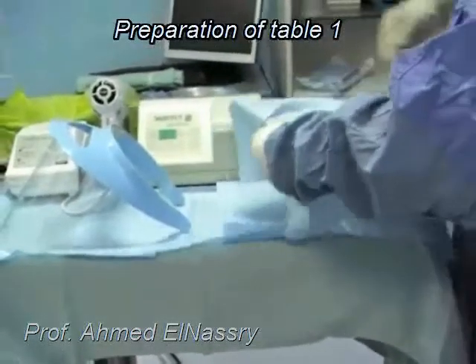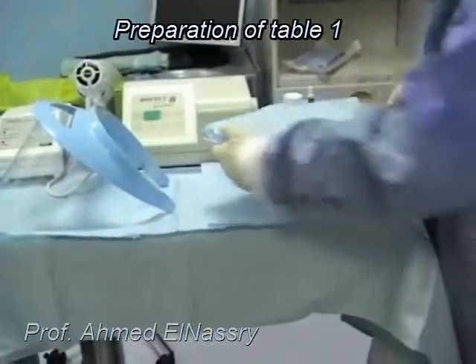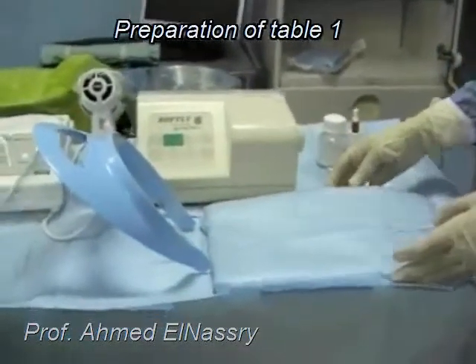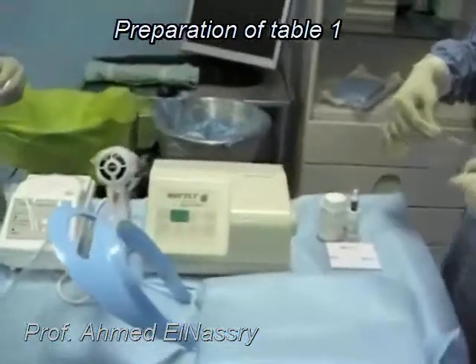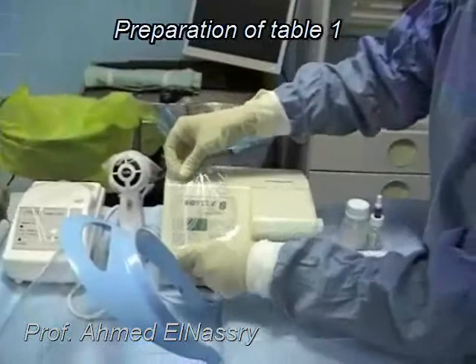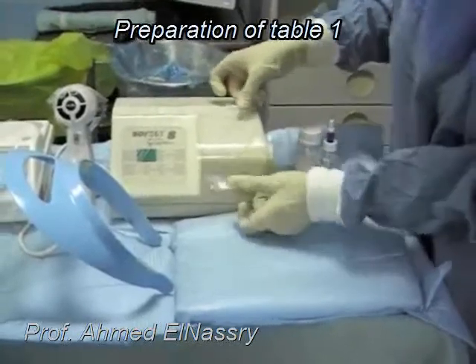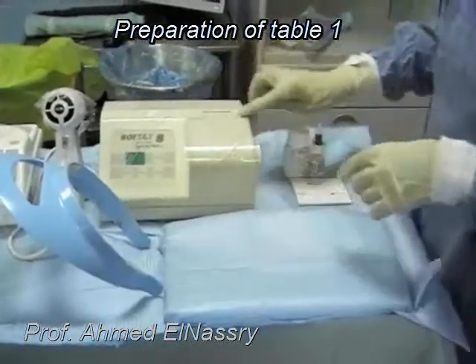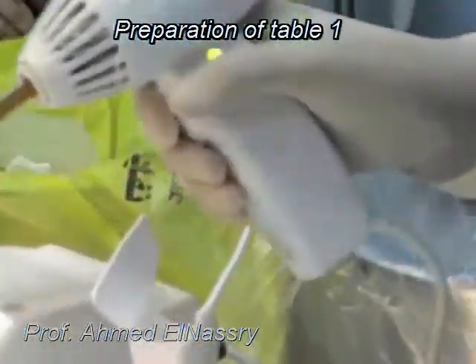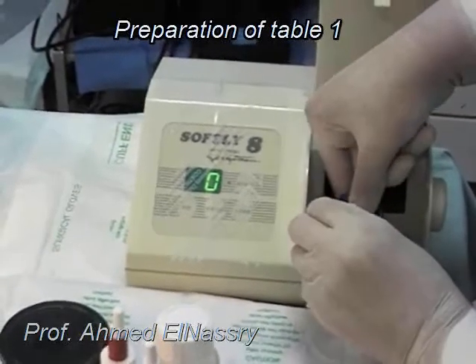A metal tray was also prepared and covered with disposable towels. Protective barriers were inserted on all touchable surfaces of the equipment — either the amalgamator or the light cure — and a double check of the light cure and the amalgamator was performed before starting the operation.